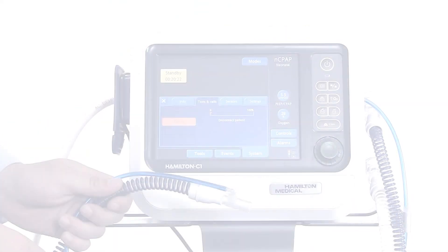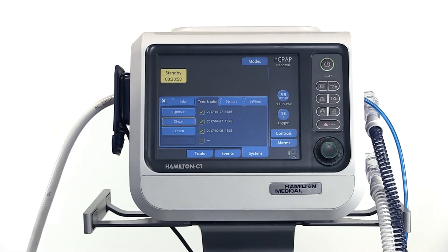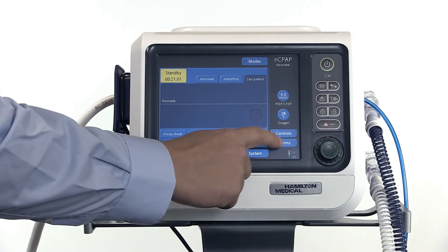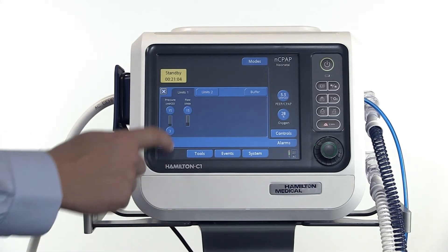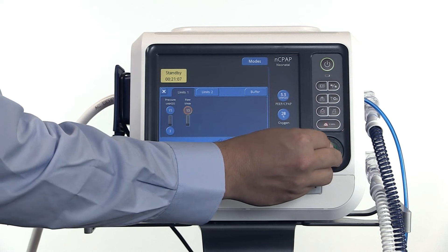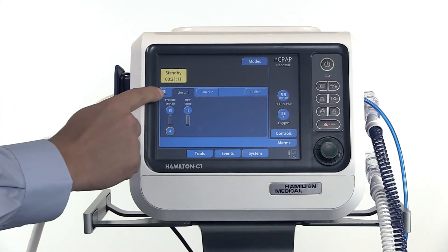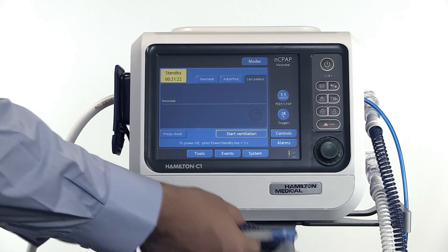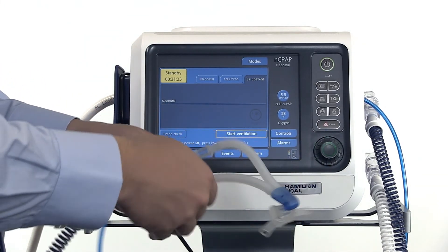After calibration has been completed successfully, close the window and check your alarm settings. Adjust the flow and pressure settings if necessary. When you have finished, close the window. Now you can connect the circuit with the NC-PAP generator and then start ventilation.